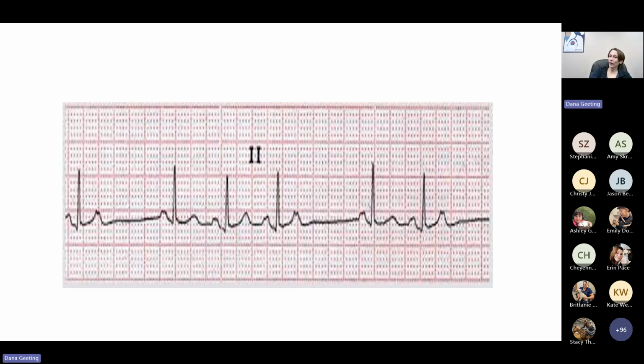Because you do have a P wave here, it's just hidden inside your T wave. If you look, this T wave looks like a normal T, and then this one has the extra little blip, and this one here has an extra little blip. So your P waves are hidden right here inside your T wave, but you're missing something right here. What are you missing?